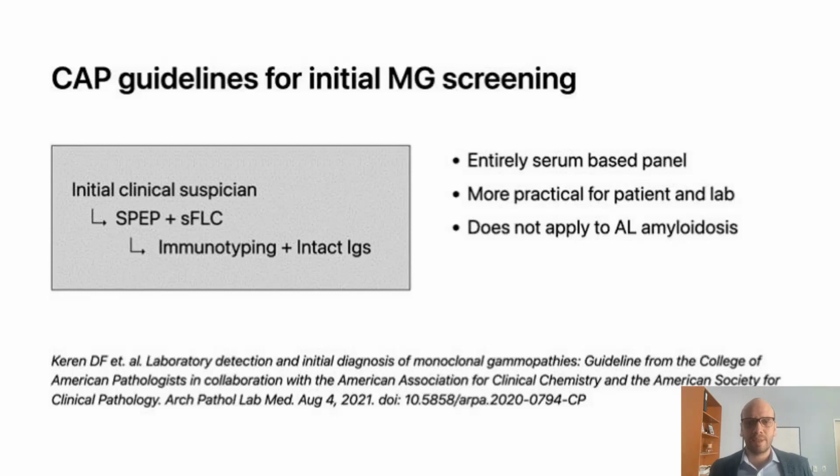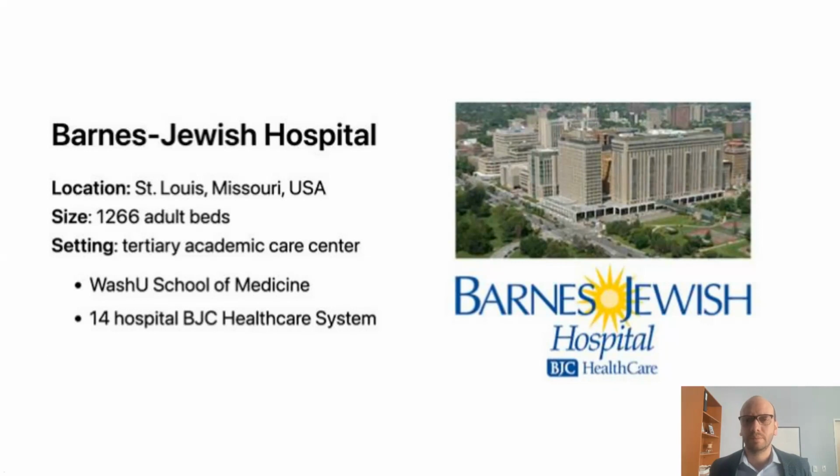Now, one important caveat here is that this panel should not be applied to AL amyloidosis. Upfront immunotyping is still the recommended strategy. So I'm going to pivot and tell you about our practice at Barnes-Jewish Hospital and our experience with this new digital workflow.